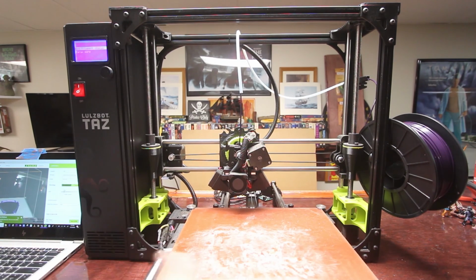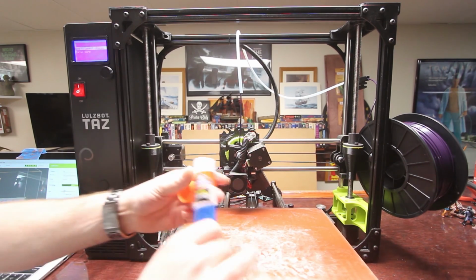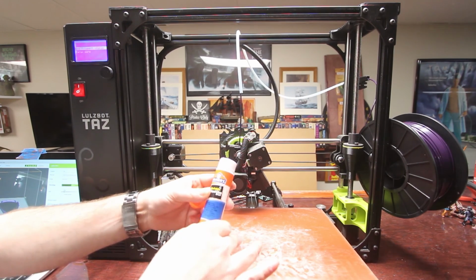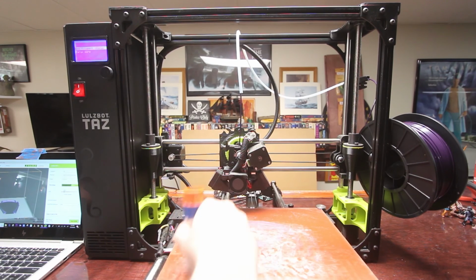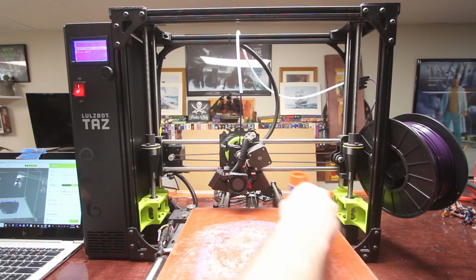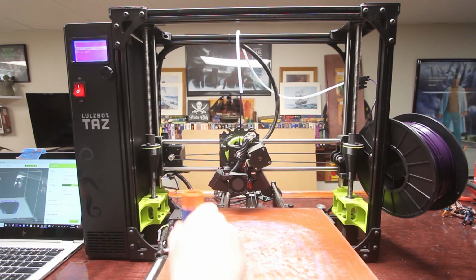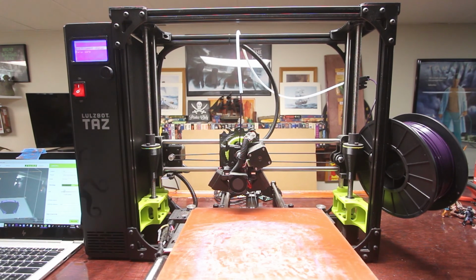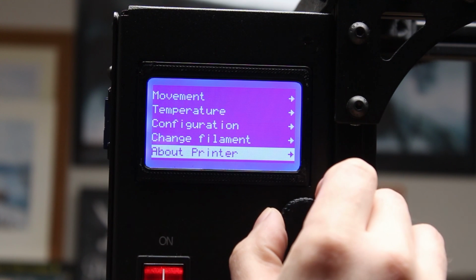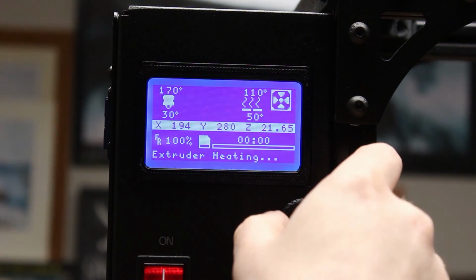And in order to help us remove our print job from the surface, we're actually going to coat it with just normal Elmer's glue stick. So we're going to give it a generous coating to help allow the 3D print job to separate from the build plate nicely. We don't want to break it when we're removing it. We want it to adhere well to the build plate. We don't want it to curl as it is printing and cooling. So we've applied our Elmer's glue. Okay, we're going to print from SD and we are going to select the North American visor frame.